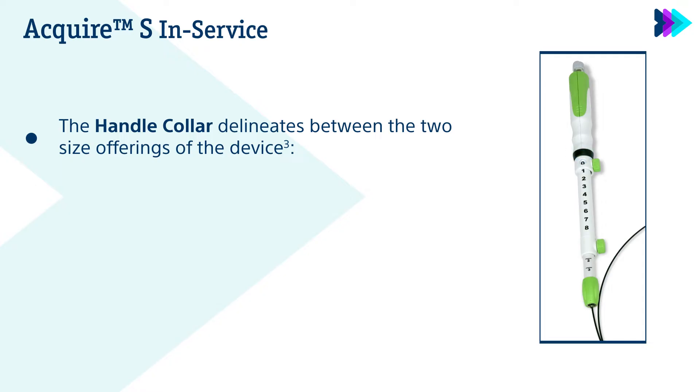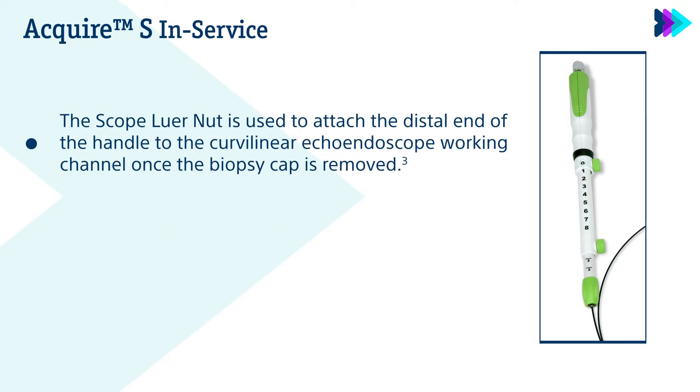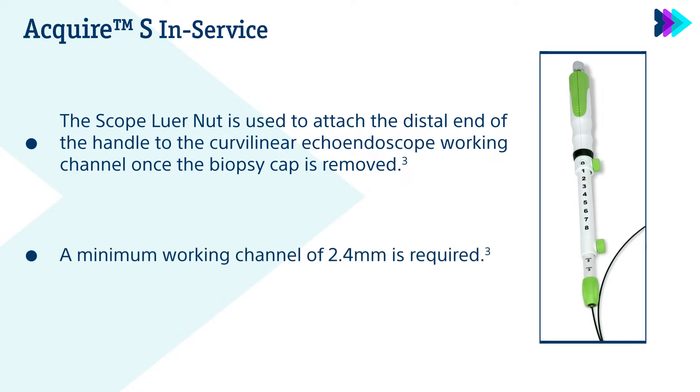The handle collar delineates between the two size offerings of the device: black for 22 gauge and orange for 25 gauge. The scope lure nut is used to attach the distal end of the handle to the curvilinear echoendoscope working channel once the biopsy cap is removed. A minimum working channel of 2.4 mm is required.